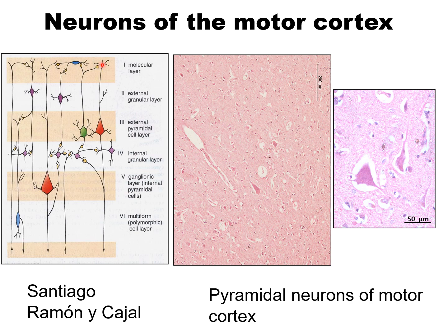The cerebral cortex, if you take a section, you can identify 6 layers: the molecular layer, outer granular layer, outer pyramidal layer, inner granular layer, inner pyramidal layer, and the multiform cell layer. In the motor cortex, this inner pyramidal layer contains the motor neurons.